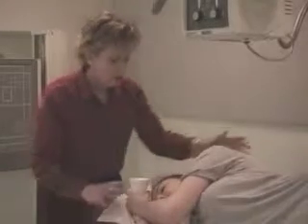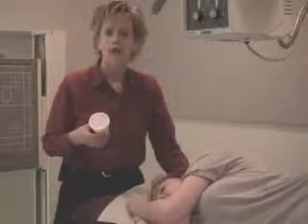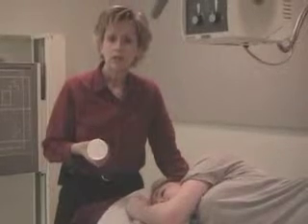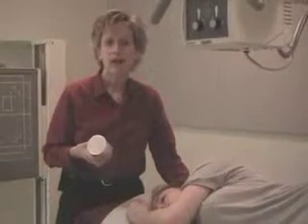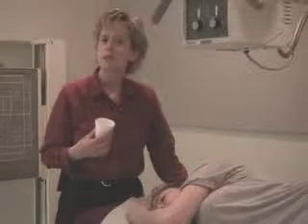Some techs prefer to thicken the barium, or use gastrographin. Other options include barium tablets, or a cotton ball dipped in barium to detect foreign objects. You will encounter all kinds of scenarios doing GI work.